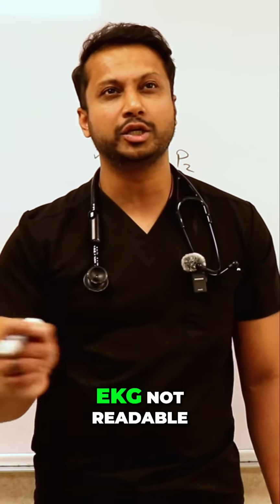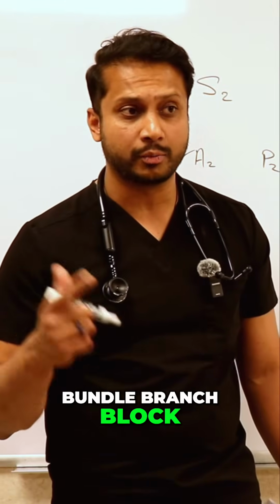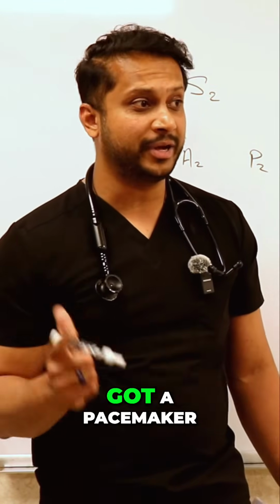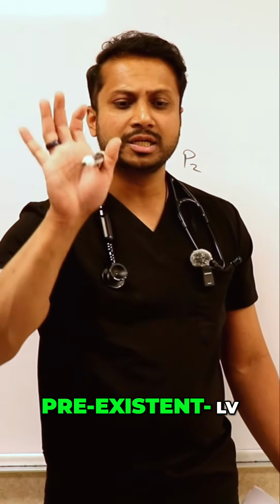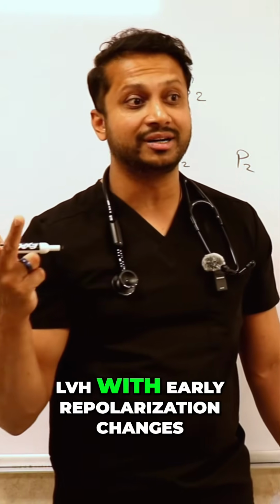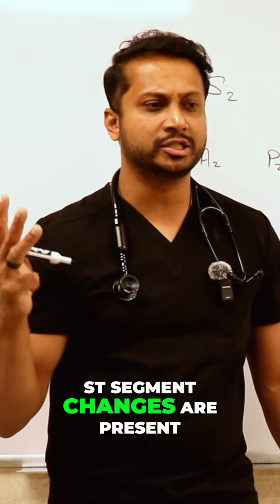What will make your EKG not readable? Left bundle. If the patient's got a pre-existing left bundle branch block, what else? A pacemaker. If the patient's got a pacemaker, what else? On beta blocker? No, you can stop the beta blocker and then you can do it. Pre-existing LVH with early repolarization changes. Great, what else? Already ST segment changes are present.